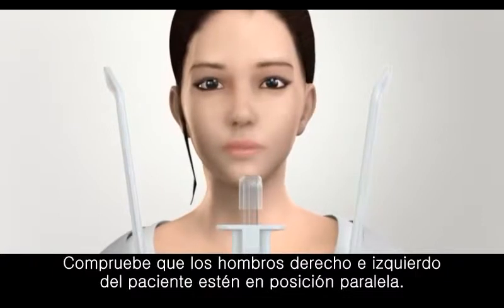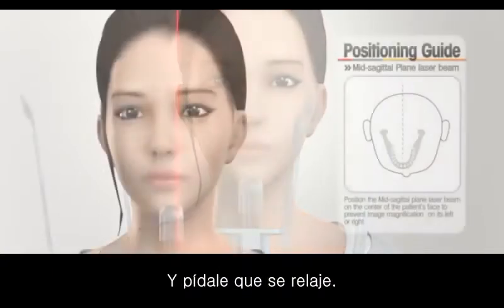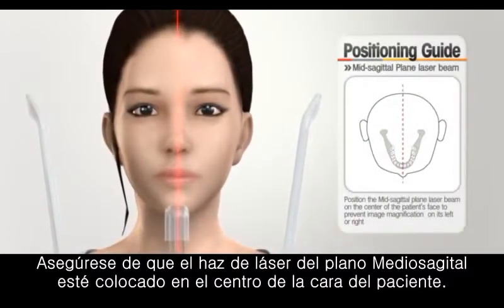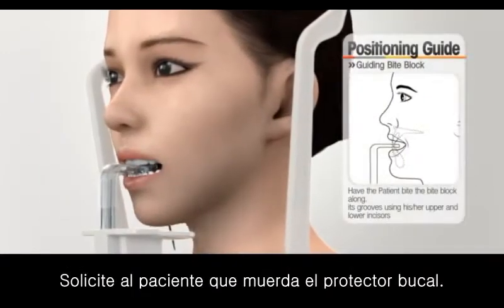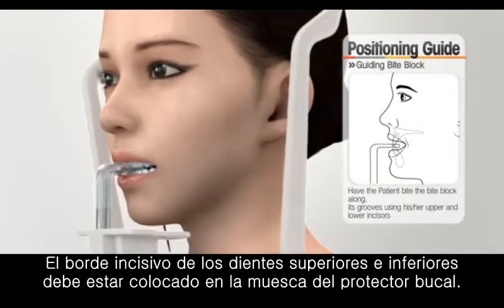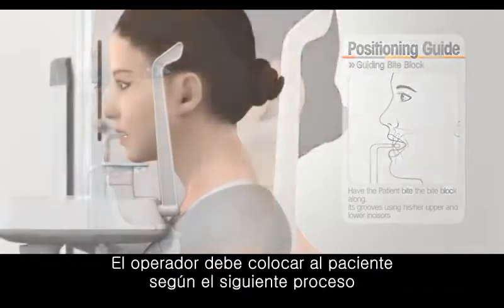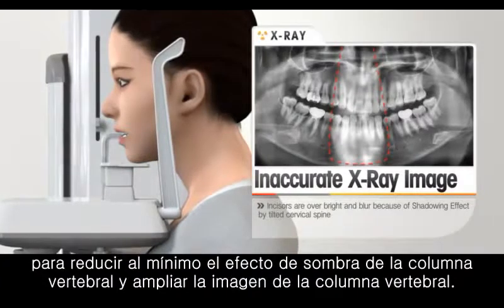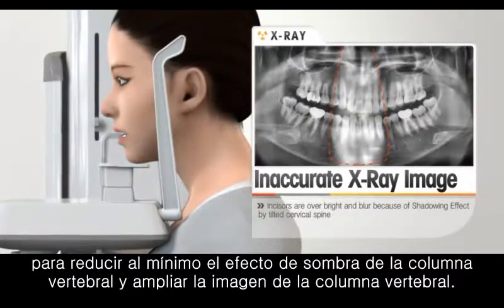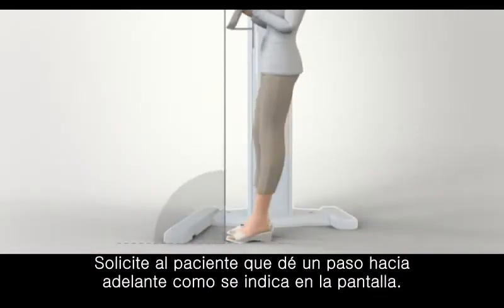Confirm the patient's right and left shoulders are parallel and lead the patient to relax. Make sure that the mid-sagittal plane laser beam is positioned at the center of the patient's face. Ask the patient to bite the bite block. The incisor edge of the upper and lower teeth must be placed on the groove of the bite block. The operator should position the patient according to the following process to minimize the shadowing effect of the spine and stretch the spinal image. Ask the patient to step forward like the screen.